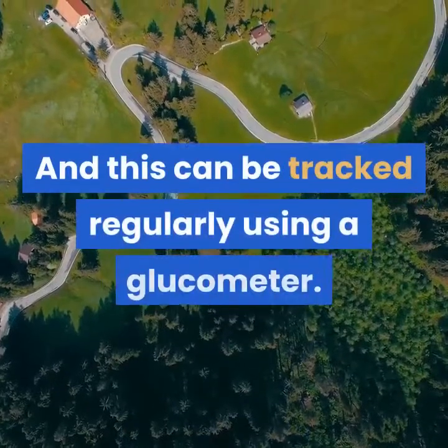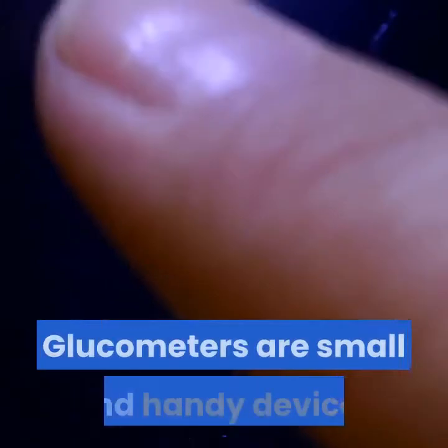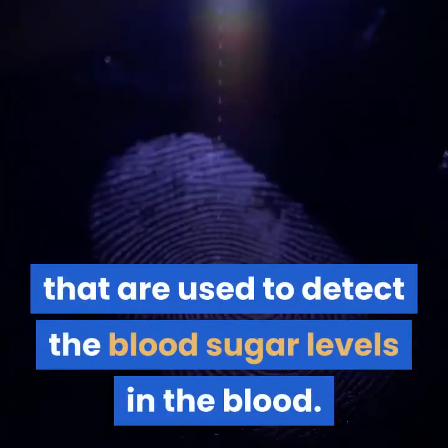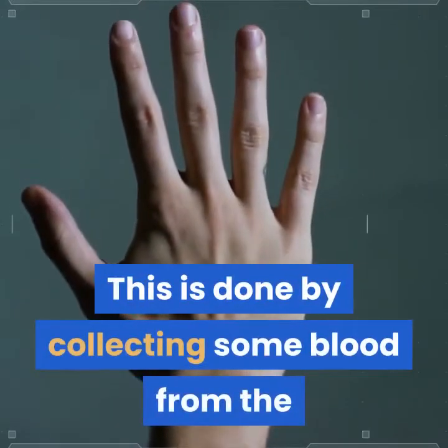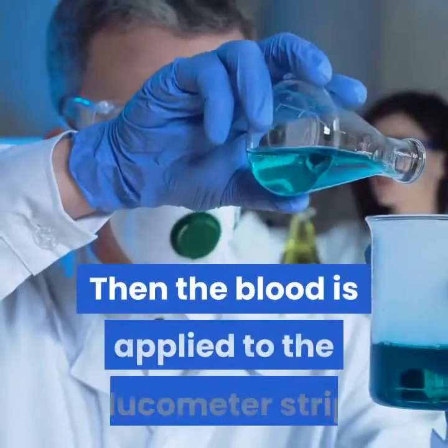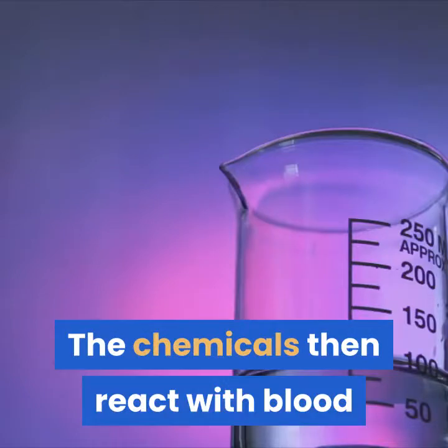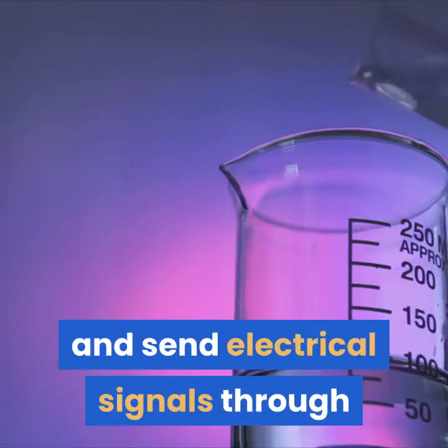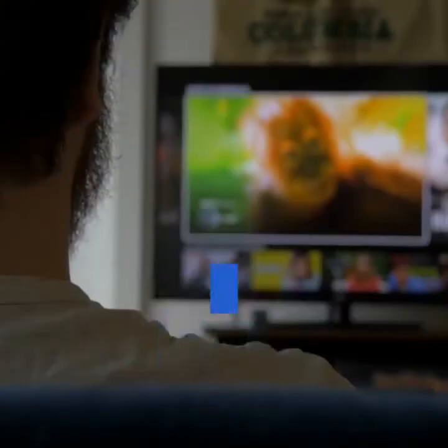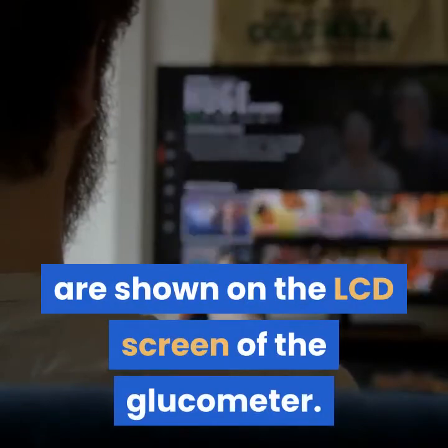And this can be tracked regularly using a glucometer. Glucometers are small and handy devices that are used to detect blood sugar levels in the blood. This is done by collecting some blood from the finger by pricking with a small pin. Then the blood is applied to the glucometer strip, which has a certain amount of chemicals in it. The chemicals react with the blood and send electrical signals through the sample to detect the sugar levels. Finally, the numerical data on blood sugar levels are shown on the LCD screen of the glucometer.